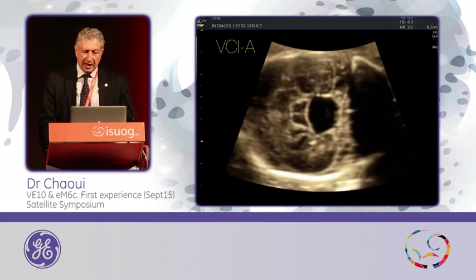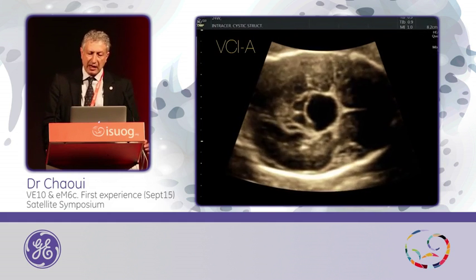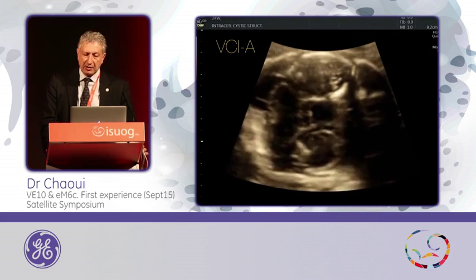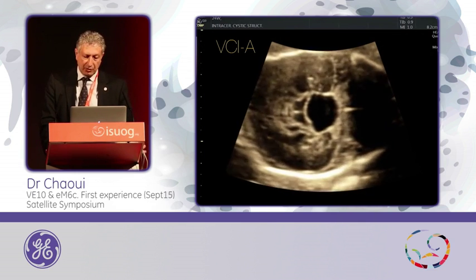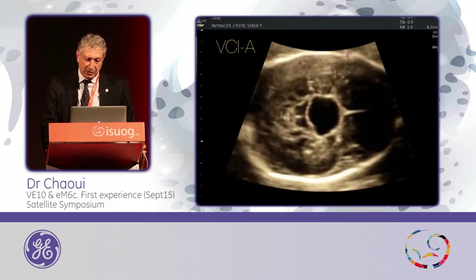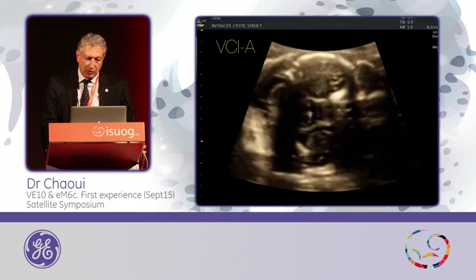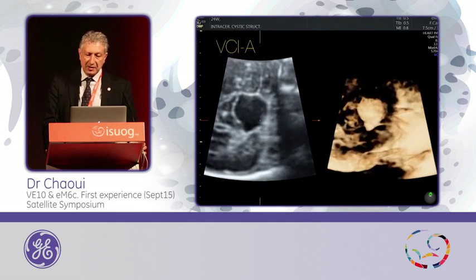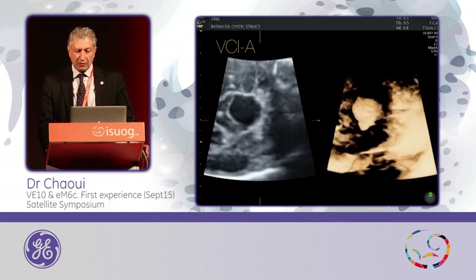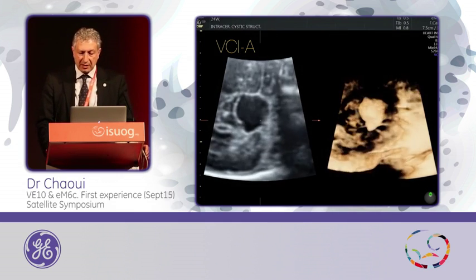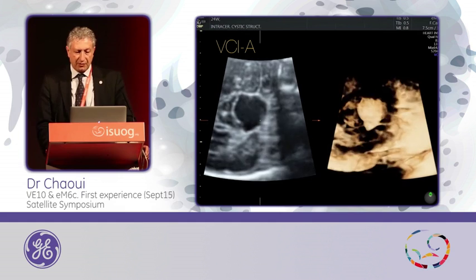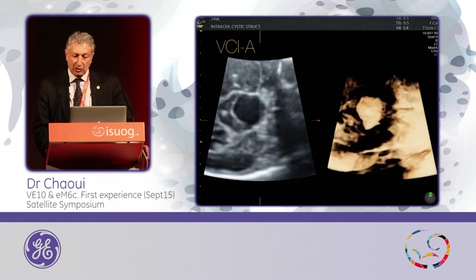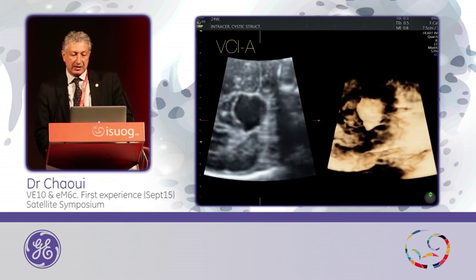Then you can use the VCI-A plane as a slice, and you see the relationship to the cerebral peduncles. I was trying to get a view to the chiasma, but I was hindered by shadowing at this stage. And then you can add VCI-A with an inversion mode to see the shape of this structure with the volume. I could have also calculated the volume of this cyst with Sono-AVC.